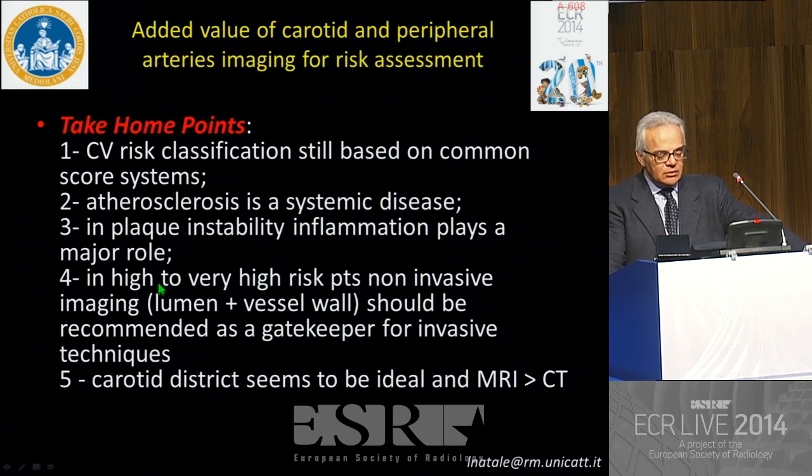In patients with high to very high risk, non-invasive imaging, intended as an assessment of stenosis but mostly vessel wall characterization, should be recommended as a gatekeeper for invasive techniques such as IVUS, for example. And finally, the carotid district seems to be ideal for this kind of evaluation with the currently available techniques, of course.